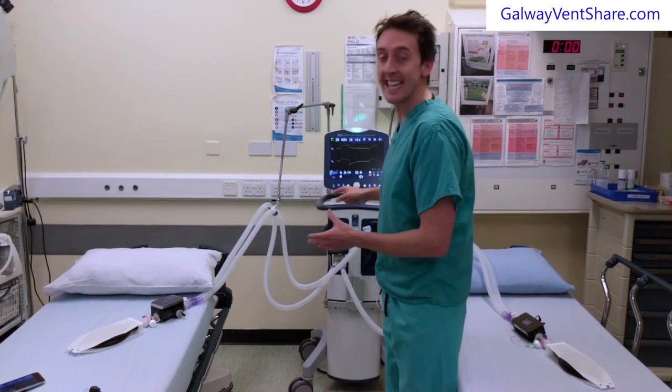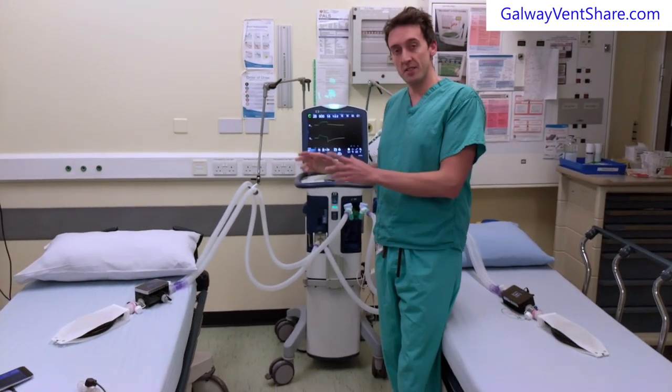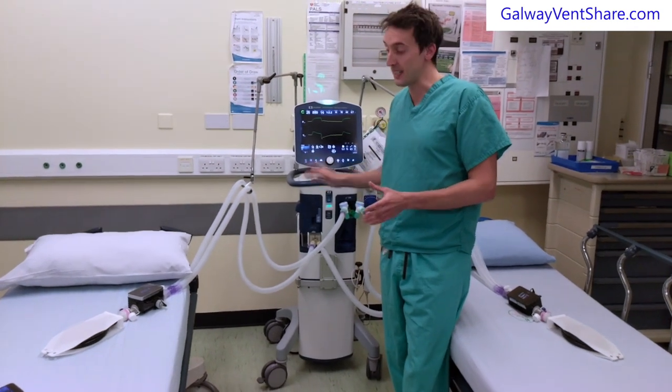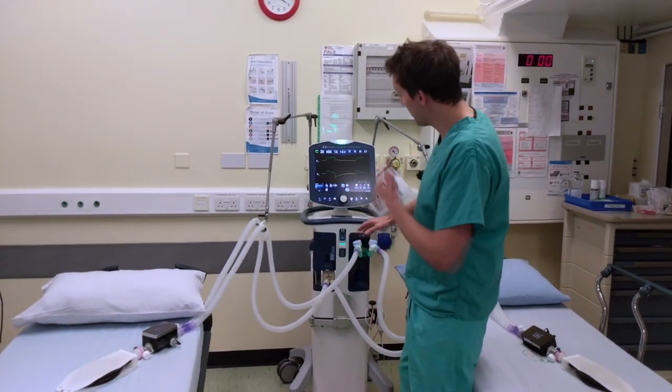What I'm going to show you today is the Galway VentShare system. This represents a way to use one source of ventilation split into two limbs to ventilate two patients simultaneously with titratable tidal volumes and pressures. So I'll just show you the way the system is set up today.